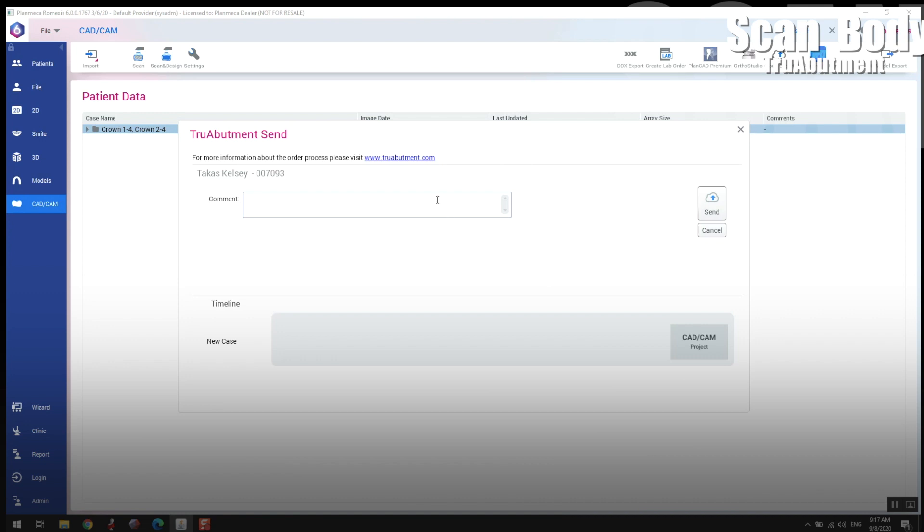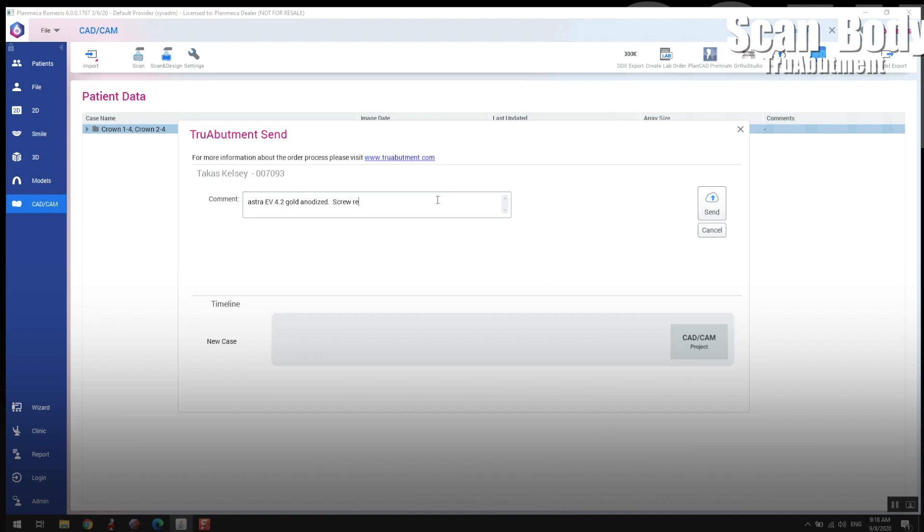The workflow for True Abutment is the same for all laboratories. It doesn't matter whether you're scanning ELOS scan bodies, True Abutment scan bodies, IO flow, you're working with True Abutment or Atlantis or any lab on planet Earth, it's the same. You could make these types of impressions. So writing a little note here and that's it guys, super easy. I hope this helps clarify how to scan scan bodies in Romexis with PlanCAD Easy and Emerald.